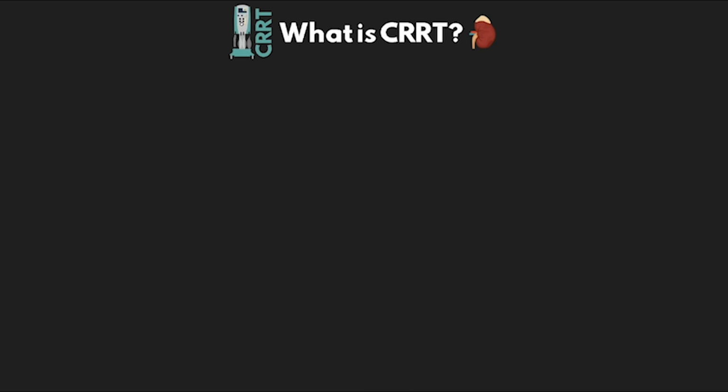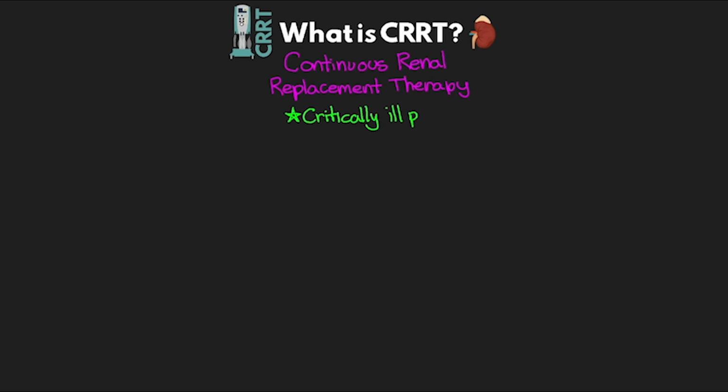Alright, let's go ahead and get started here, and let's start off talking about what exactly is CRRT. CRRT stands for Continuous Renal Replacement Therapy. CRRT is a therapy that really is in the same class as intermittent hemodialysis, IHD, or peritoneal dialysis, PD. What CRRT is designed for is the critically ill patient who oftentimes is unable to tolerate the rapid, short iterations and the accompanying fluid and electrolyte shifts that we typically see with intermittent hemodialysis.